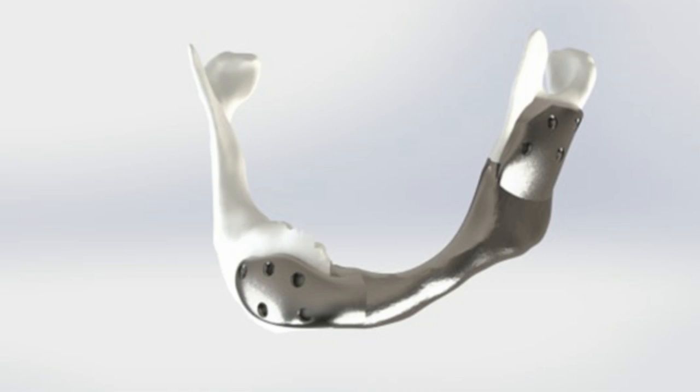The new 3D-printed mandible exactly fits the defect, has the shape and weight of the original mandible, and is much stronger than the currently used plates. Functions such as swallowing, drinking, and eating are preserved.